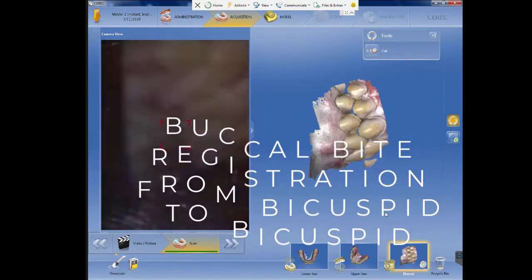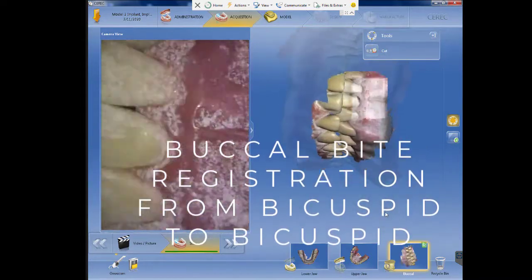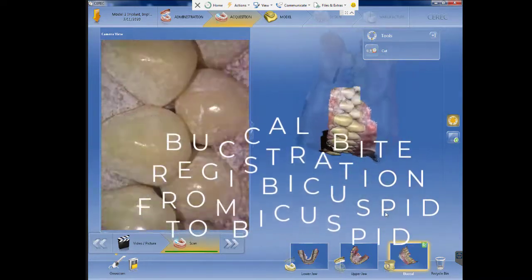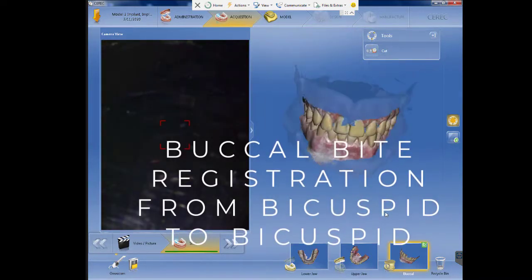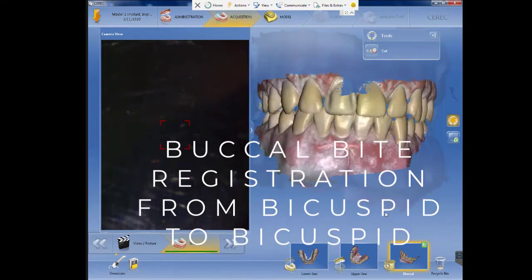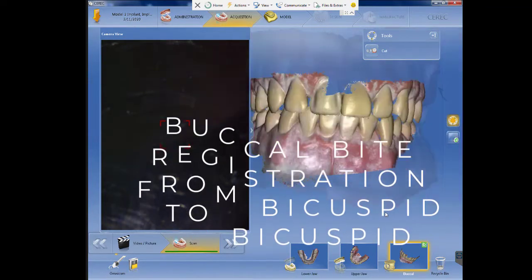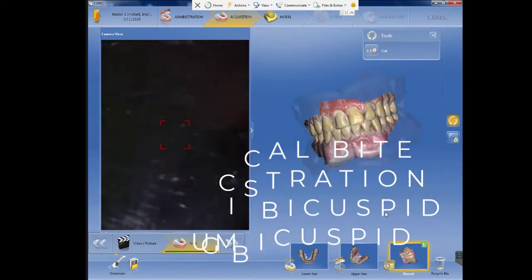After this you will do the buccal bite registration from pre-molar to pre-molar, bicuspid to bicuspid, and this will ensure the proper aligning of the models.